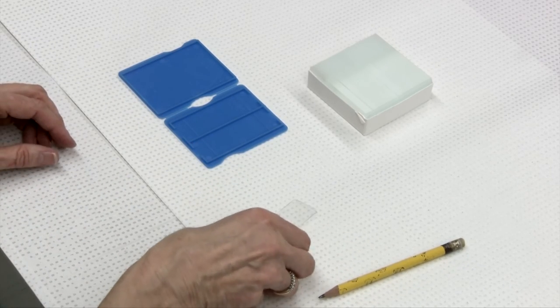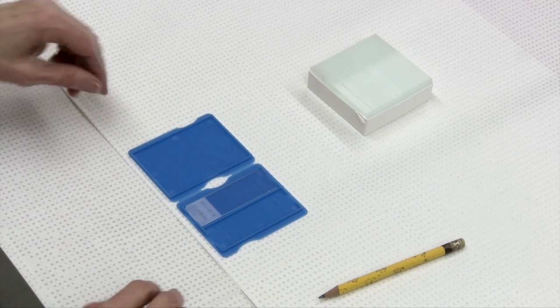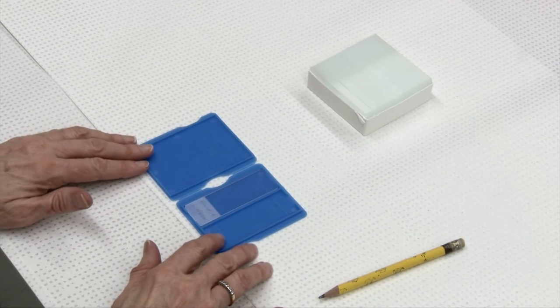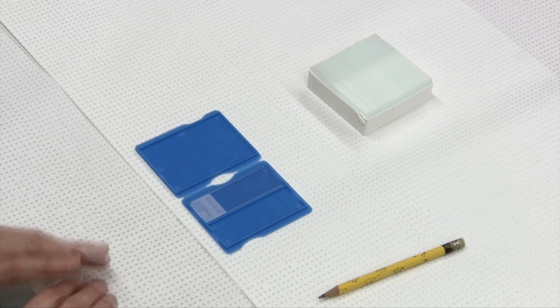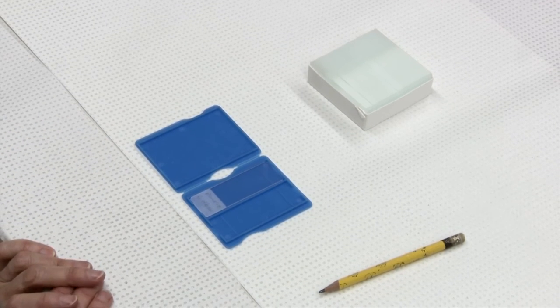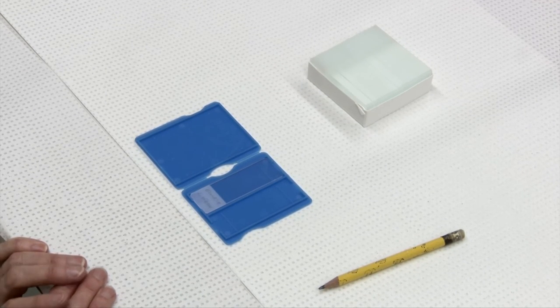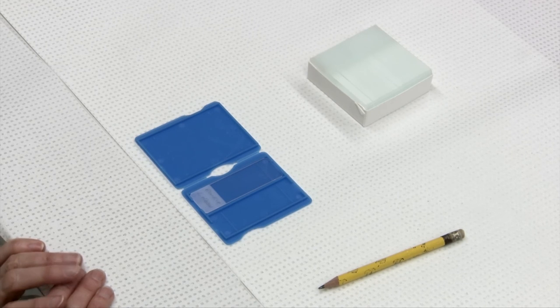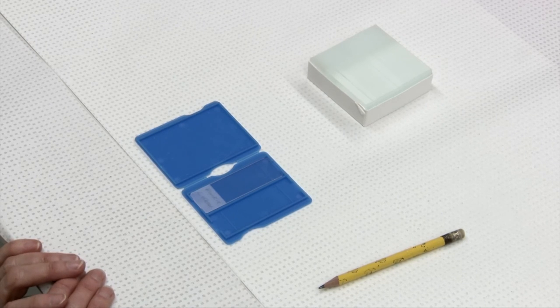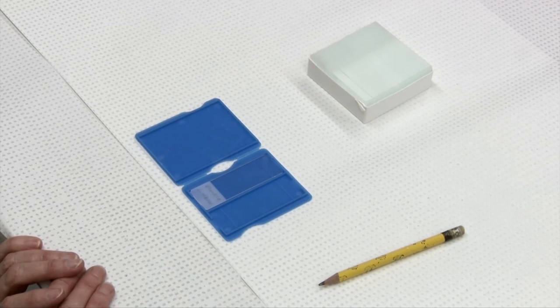Any smears you have can be placed into a slide protector, which will keep them protected for submission. You want to have at least two or three smears from each site if possible. Sometimes you will perform more than one aspirate on a larger mass, or if the material obtained is not adequate, you would certainly repeat your aspirate.